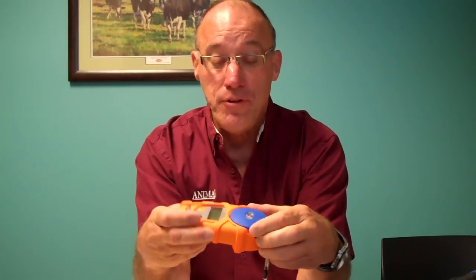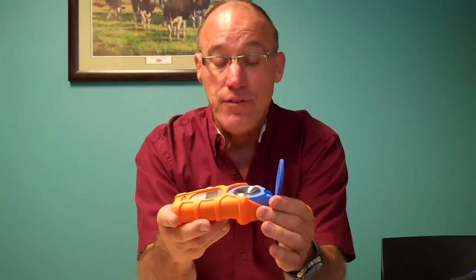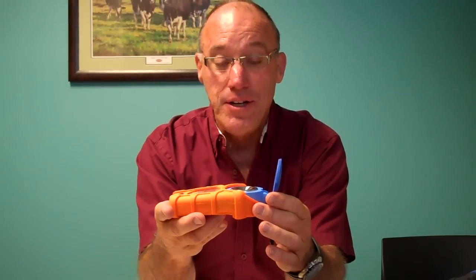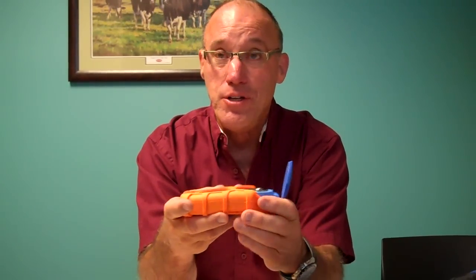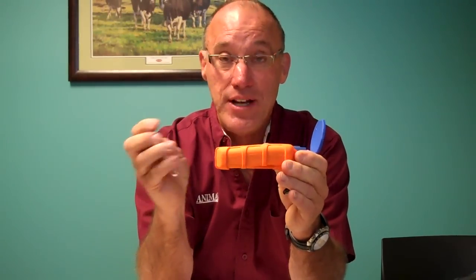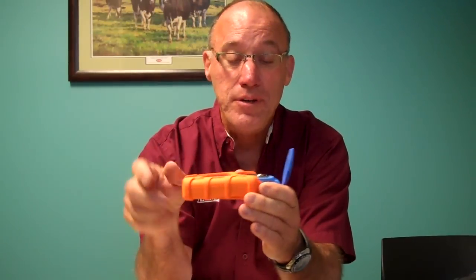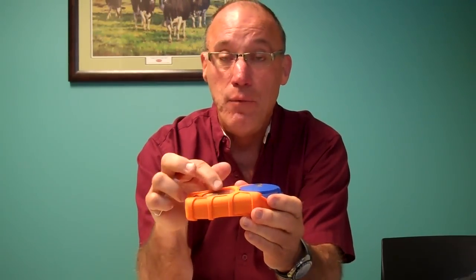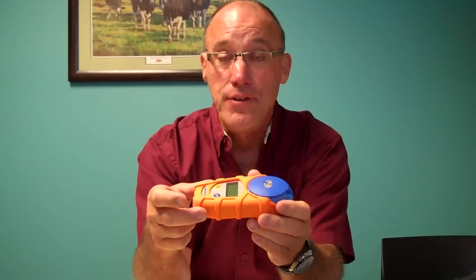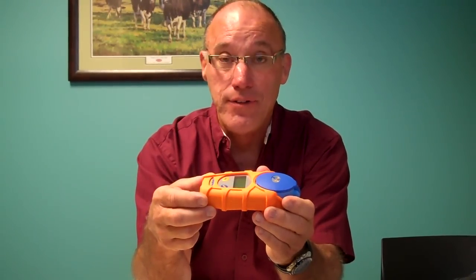The other instrument we have does both measurements, so this one has the Brix scale for colostrum quality as well as the scale for total protein. If you do total protein, you would draw some blood from the calf, let it clot in this tube, then take a couple drops of that serum — the liquid part after it clots — and put it on the little piece of glass here, close it, and that will read what your total protein is on that calf, which is a measure of whether the calf got enough colostrum.